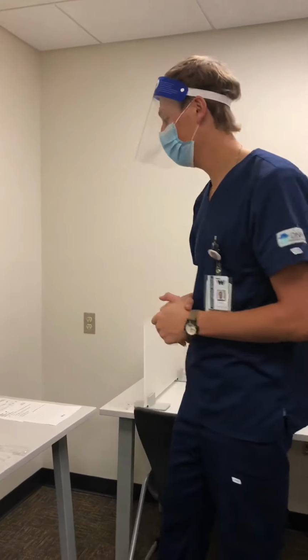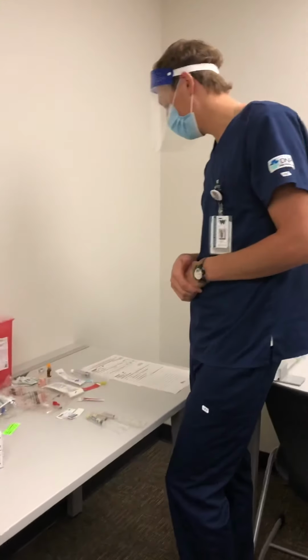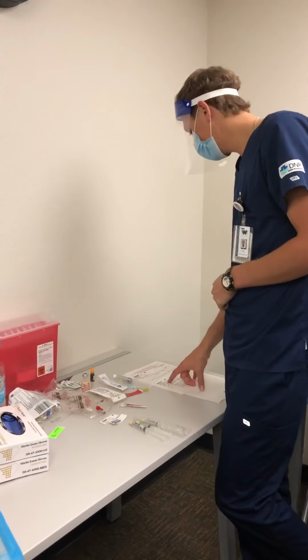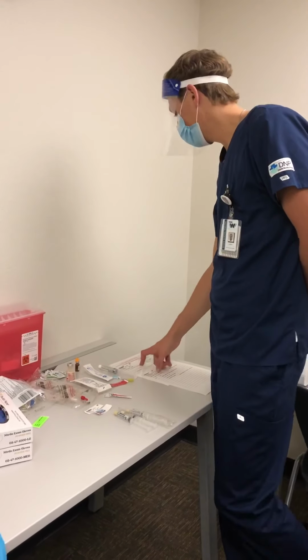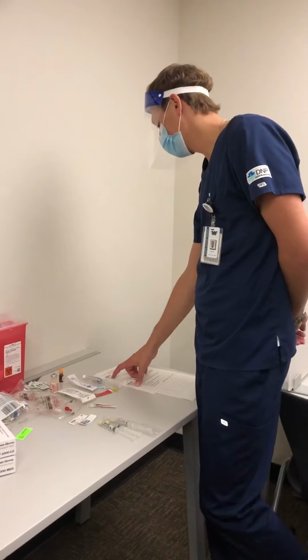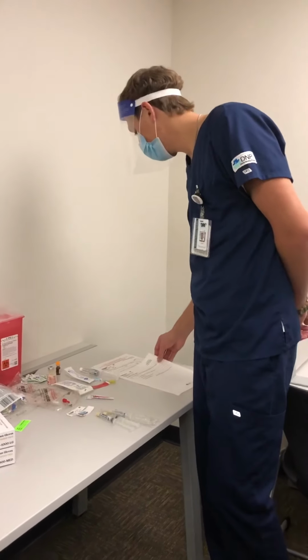So to begin here, I'm going to verify my MAR with my healthcare provider orders. I have Ms. Shirley Coast here, date of birth 4/3/87, with an allergy to codeine. That's on my healthcare provider order. And then here on my MAR, I have that matching information, Shirley Coast, 4/3/87, with an allergy to codeine. So that all matches out.